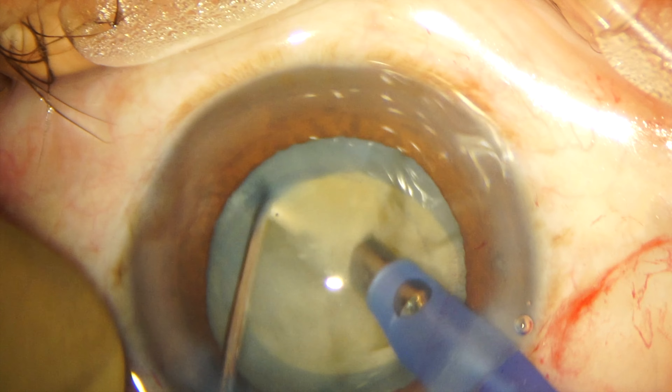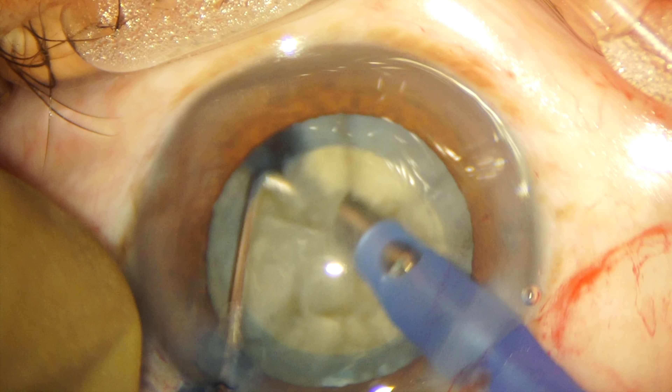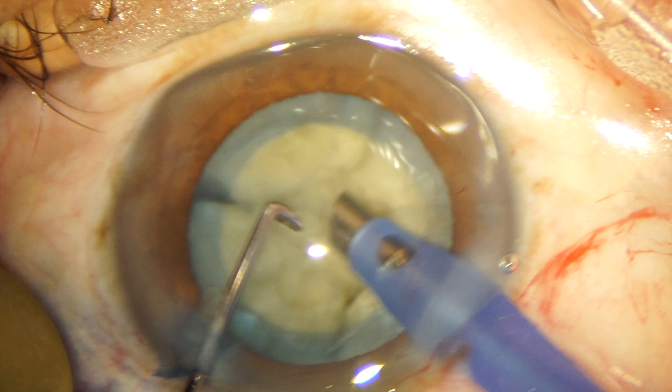As you can see, we have to initiate the chop in a superficial plane and then go again deeper to achieve complete separation of the nuclear fragments. This is the multi-planar chopping technique.